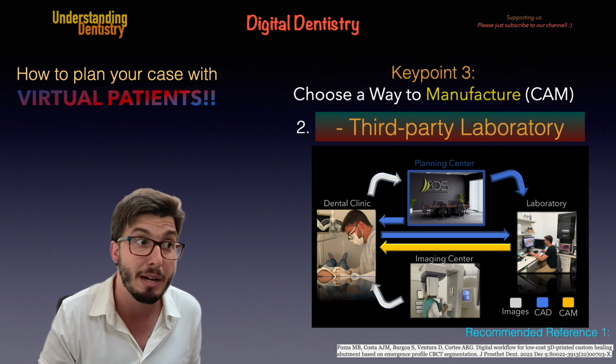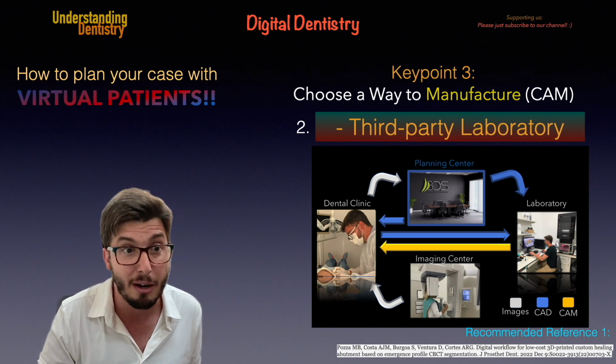So this is just a summary about digital workflow in dentistry and how to work with virtual patients.